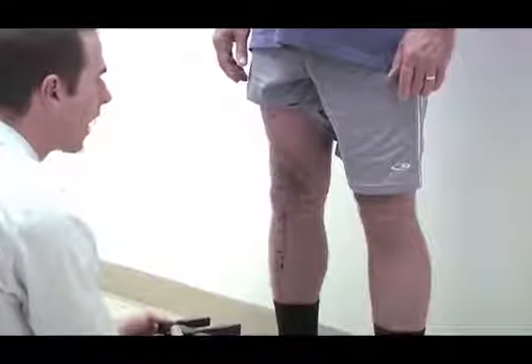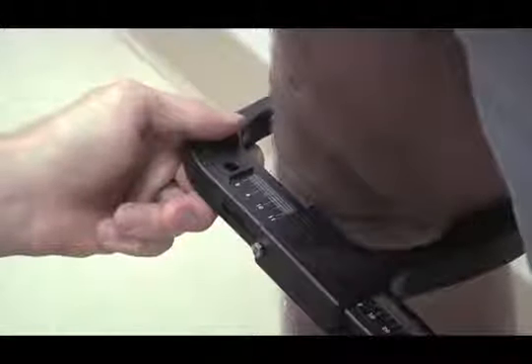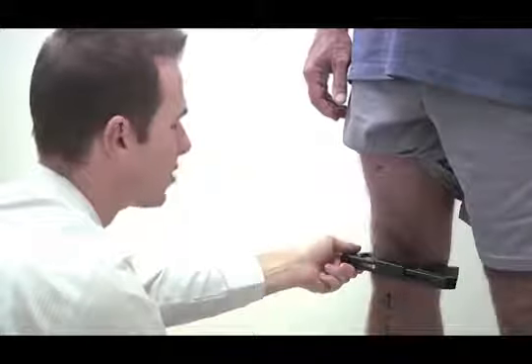Next, we'll be taking the ML measurement with the constant force caliper tool. Be as accurate as possible, as this is a very important step in the measuring process. Align the top of the caliper tool with the knee axis line and allow it to sit for approximately 3 seconds. Note the measurement and enter it into your SmartMeasure app.